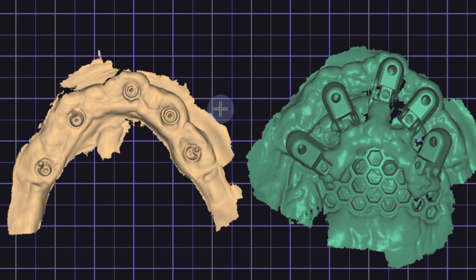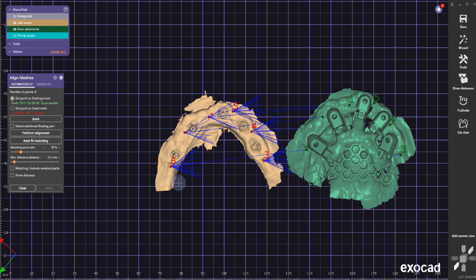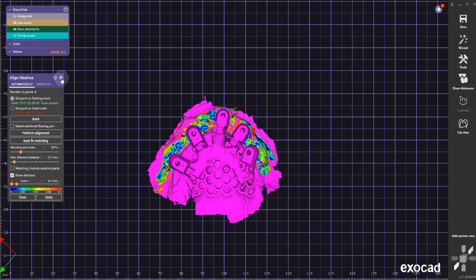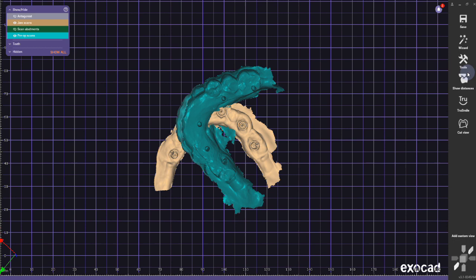The doctor did a really nice job scanning the case. Here I have a lot of tissue to align, so I'm going to find similar points, click on that. Usually I pick like five or six points on a scan body scan—best fit matching—and get out there.